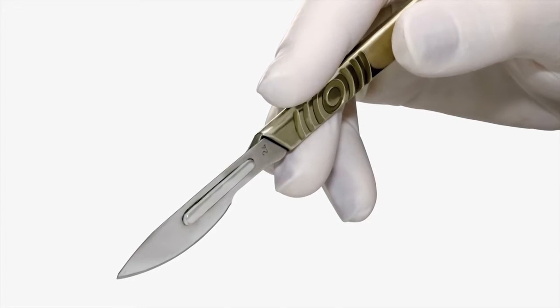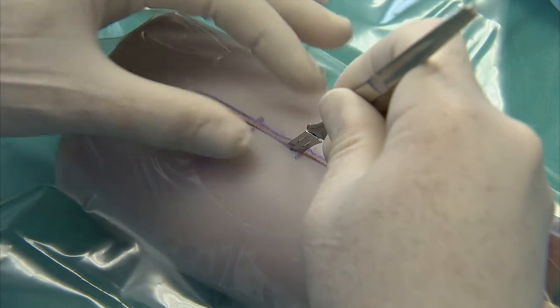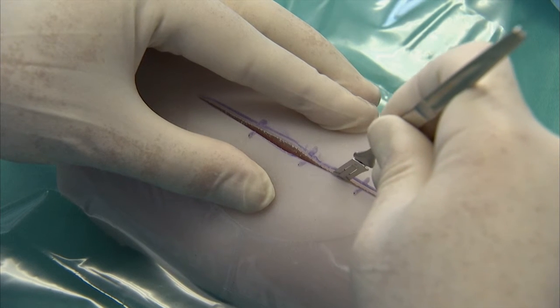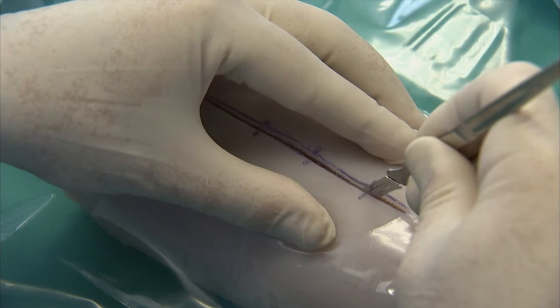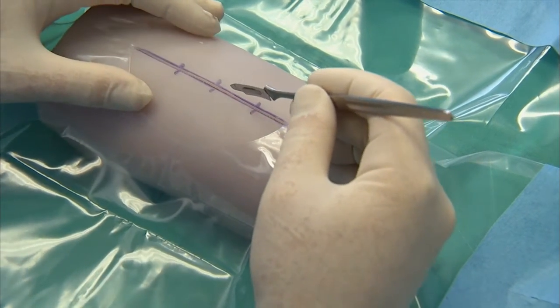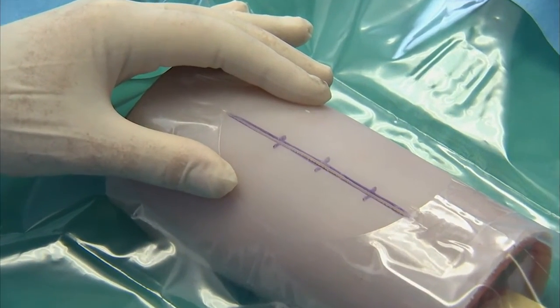Figure 1 shows the correct way to hold a scalpel. Make the incision decisively. Cut through the epithelium as well as the dermis. In a real patient, one would inspect the wound margins for bleeding at this point in time. Warning: take great care when working with sharp instruments. The scalpel is very sharp and can cause serious injuries if it slips.